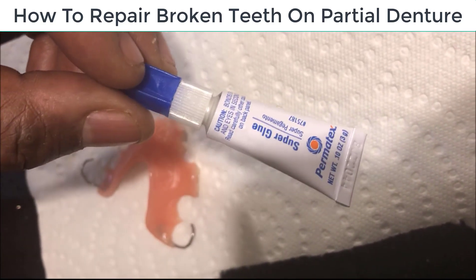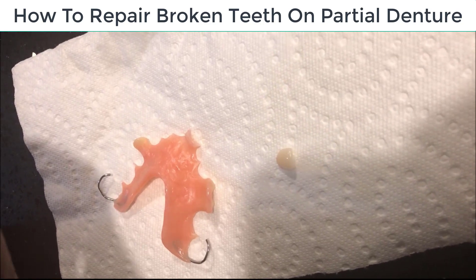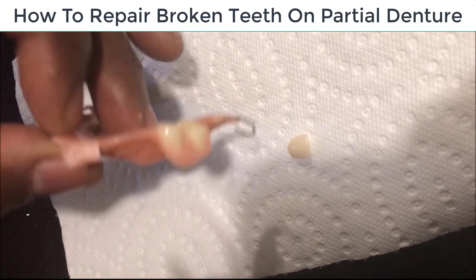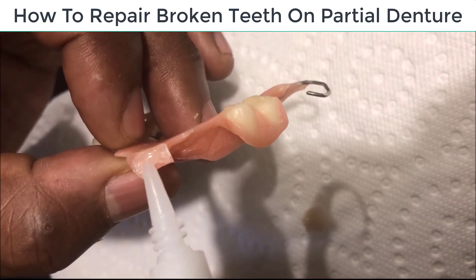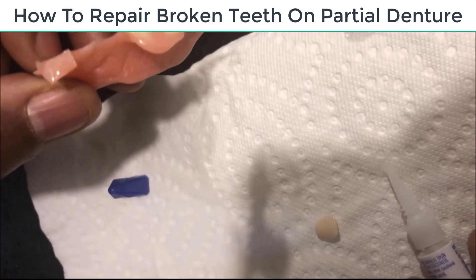A couple of months ago, my niece had one of the teeth break off on this partial dental. I'm going to show you what we did here. You got some super glue, just regular super glue. You can get this anywhere — Walmart, your CVS, your hardware store.